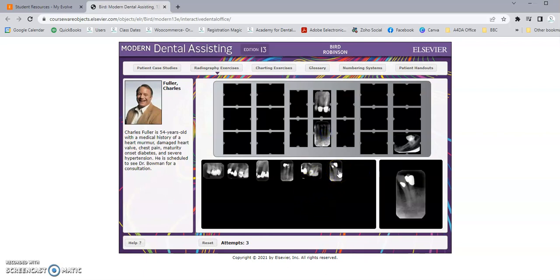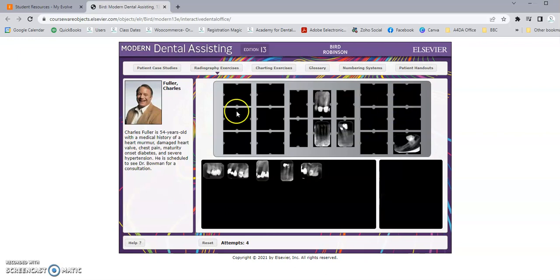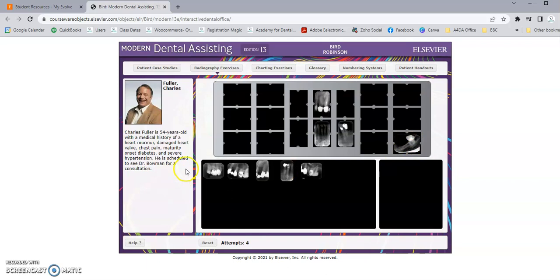This one looks like it's my canine shot because I can see a little bit of the anterior teeth. Up in the mount, just by knowing the layout — it goes molar, premolar, canine, central — the molars are always on the outside. So: molar shot, premolar shot, canine, centrals, canine, premolar, molar. And then these are our four bite wings. The same layout applies down below: molar shot, premolar shot, canine, centrals, canine, premolar, molar. It's just like looking in the mouth.